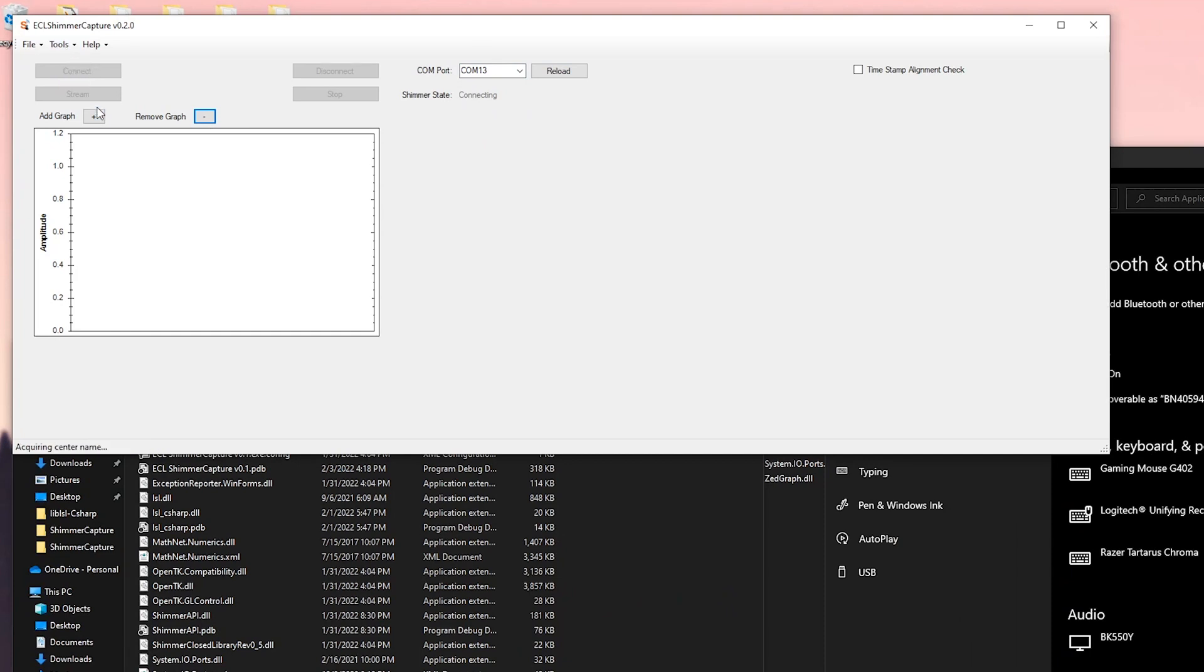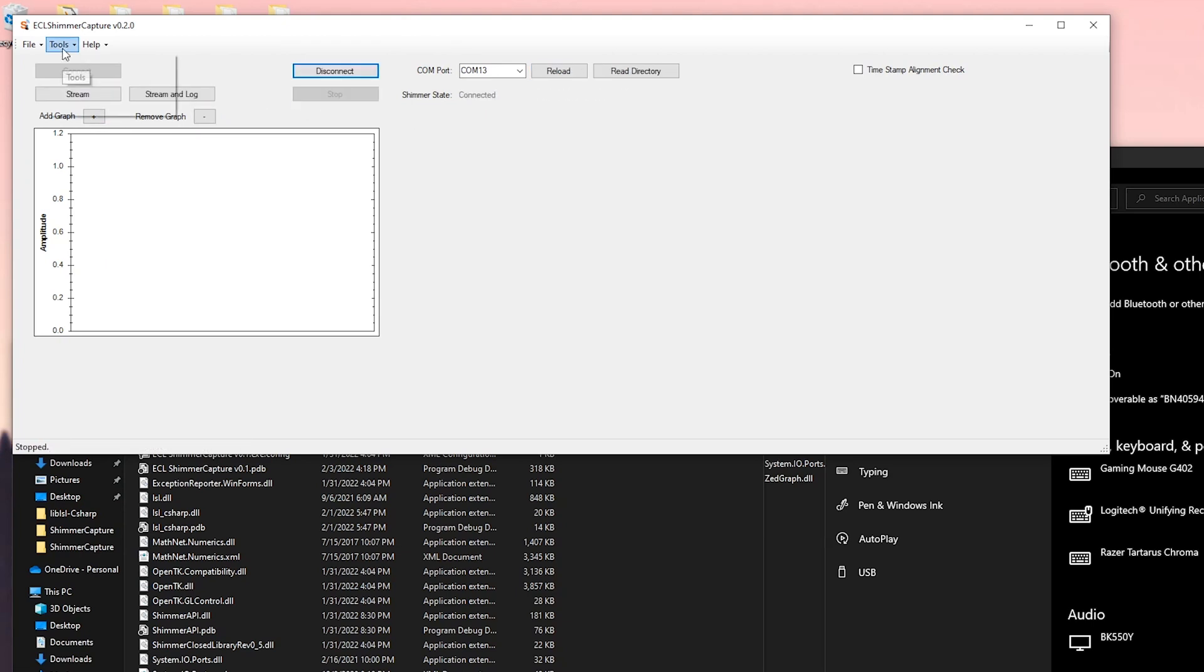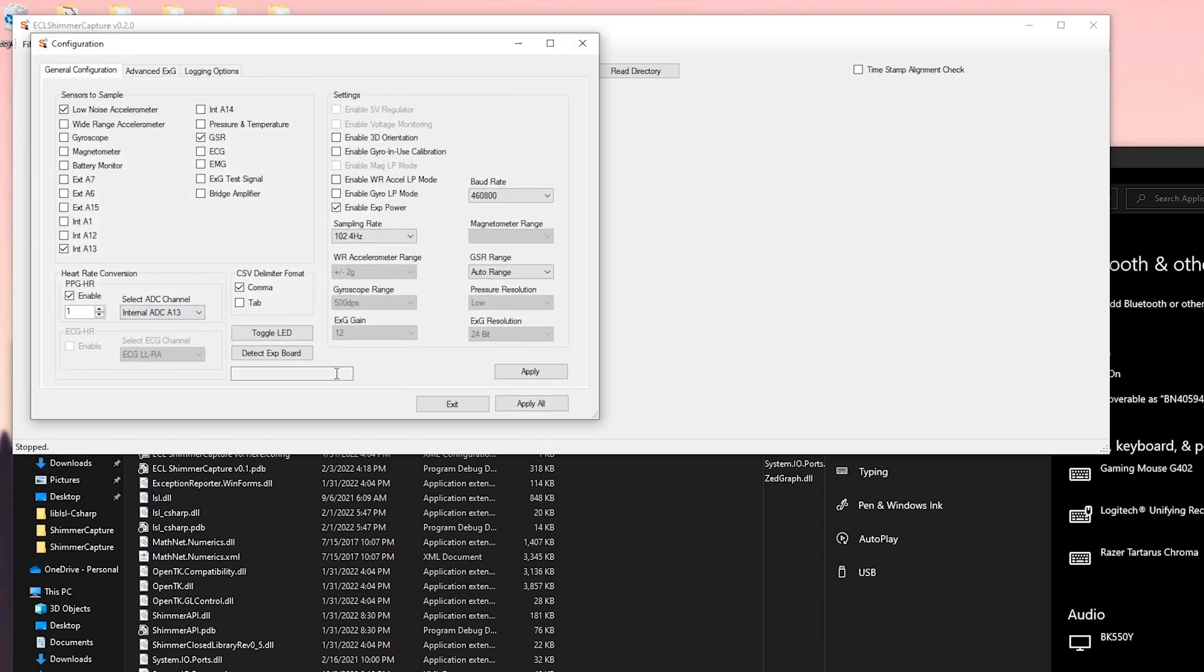Click stream and it will stream the information. You can configure things like showing heart rate in tools config and select PPG to heart rate. It will take a 10 second sample of PPG to calculate the heart rate.